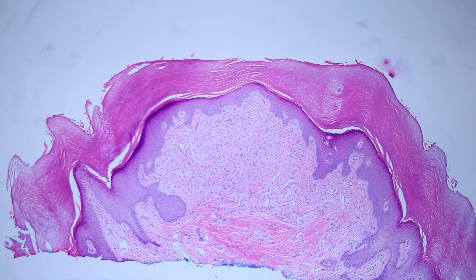Here in the dermis we have a proliferation of spindle cells — that's what's causing this little bump. So let's see if we can figure out what those are.